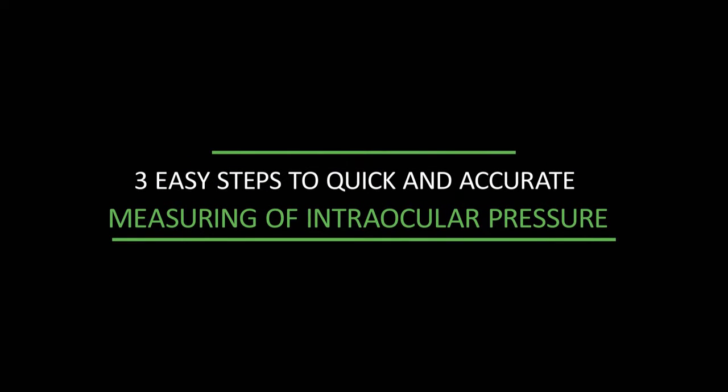It takes three easy steps to measure intraocular pressure quickly and accurately.